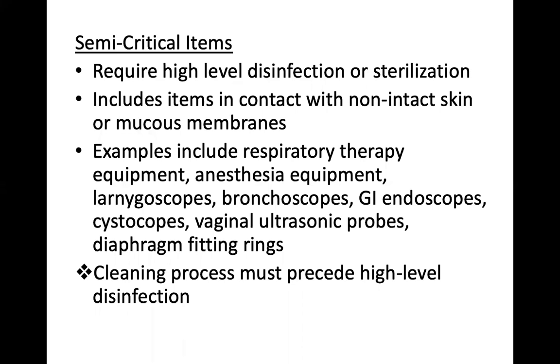And put it on the skin, the risk of infection is not as high as taking a thermometer and putting it in the patient's rectum, for example, okay, in the anal cavity. The risk of infection is higher in the mucous membrane compared to intact skin. So think of respiratory therapy equipment, anesthesia equipment, laryngoscopes, bronchoscopes, GI endoscopes, cystoscopes, vaginal ultrasonic probes, diaphragm fitting rings, etc.